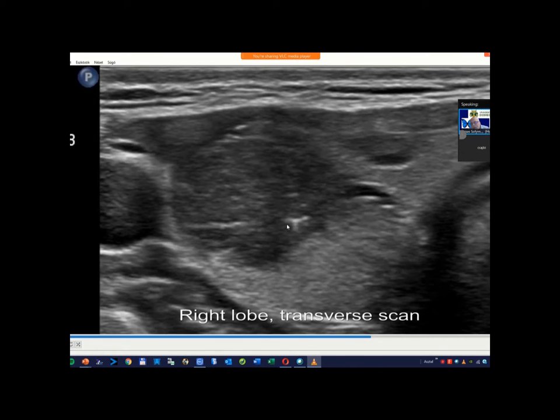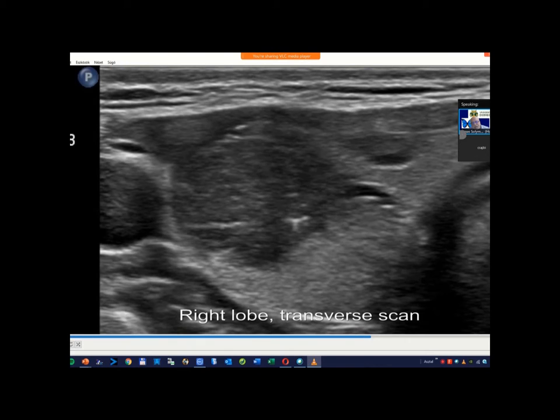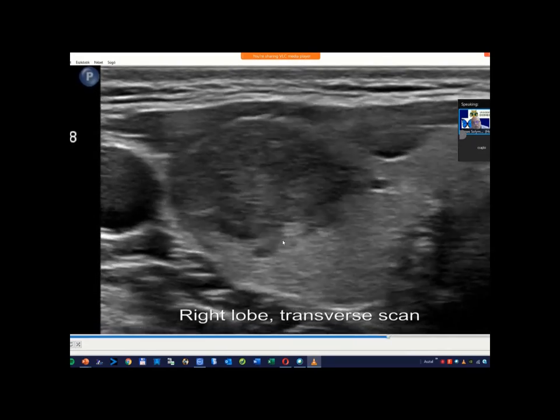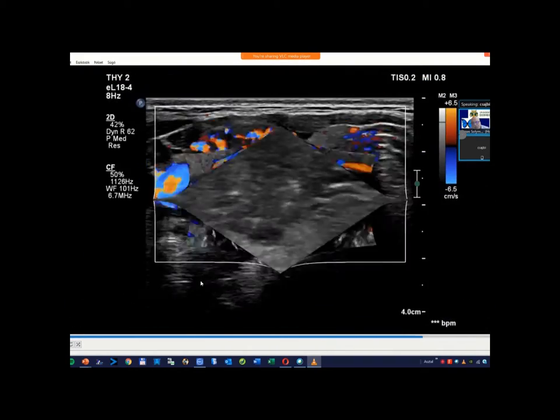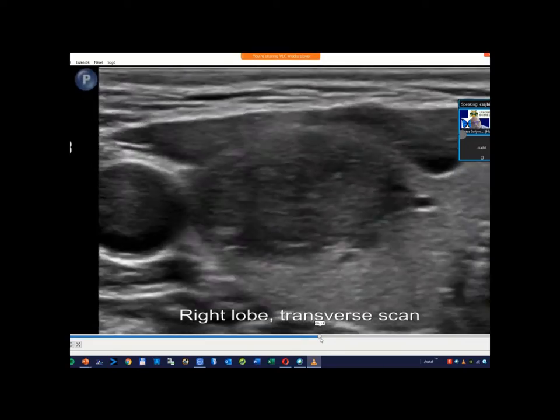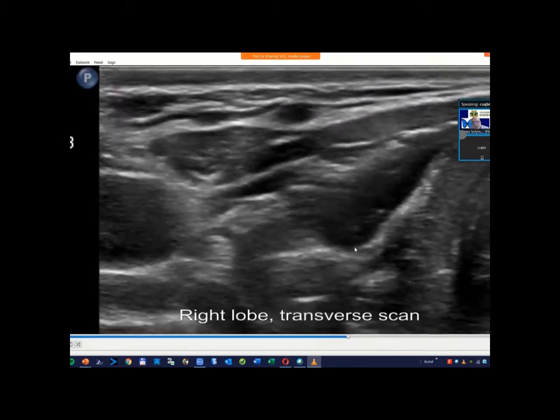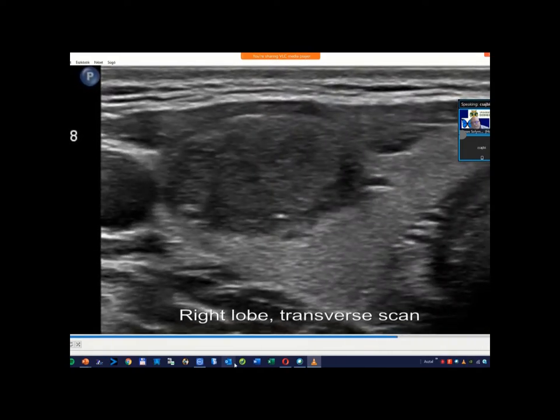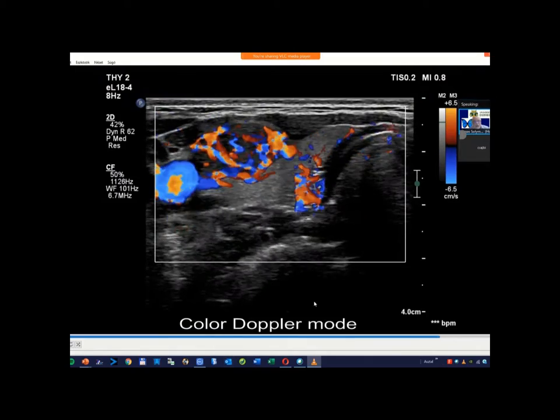This form cannot be interpreted other than a cometary artifact. But it would be an unusual finding. The Korean guideline states that if we see cometary artifacts, the nodule should not be evaluated by cytology. This is a good example of why the Koreans are wrong, I think. Maybe this is a technical artifact, but whoever judged this as a cometary artifact — I cannot oppose that interpretation.